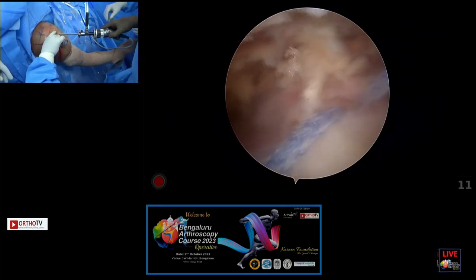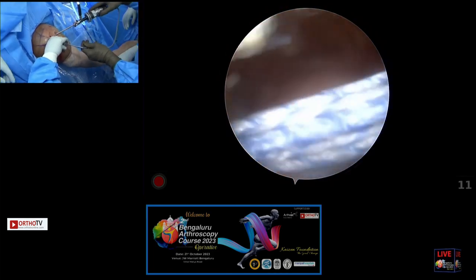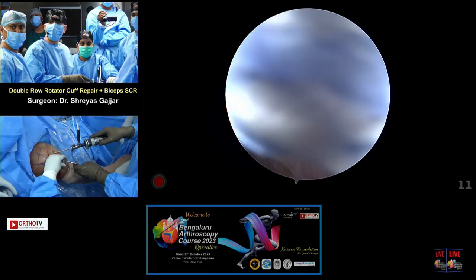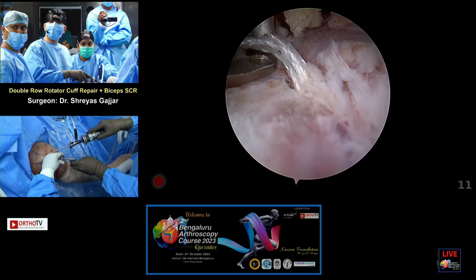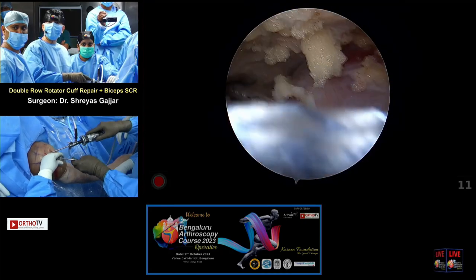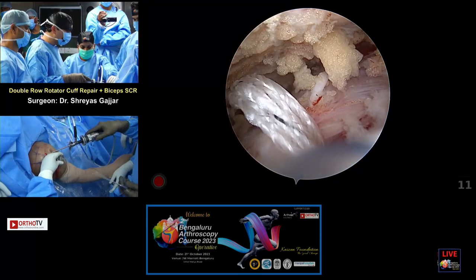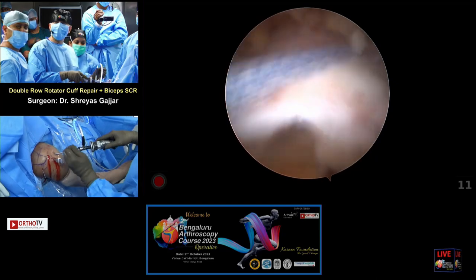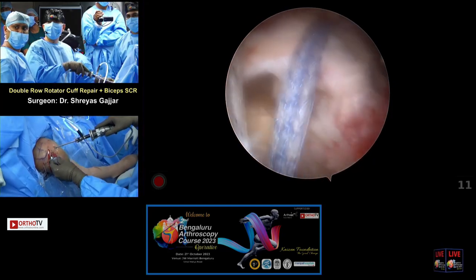Thank you, sister. Dr. Shreyas, considering this is a small tear, but suppose you have a large tear, how do you decide how much anterior you need to go? So anteriorly with the tapes, I can only go where my anchor insertion points are, but you can use the dog ear stitch to get an additional purchase. Here, I don't expect any dog ears. You see the cuff is sitting nicely here, so I don't expect anything.